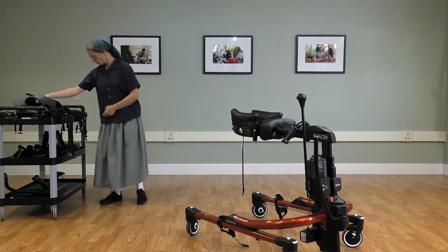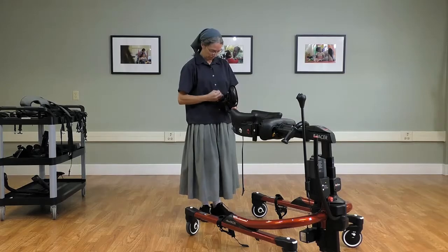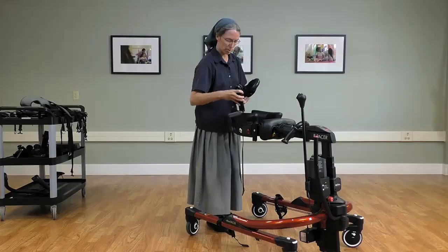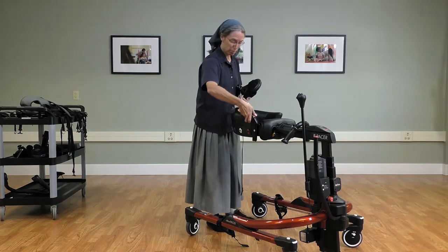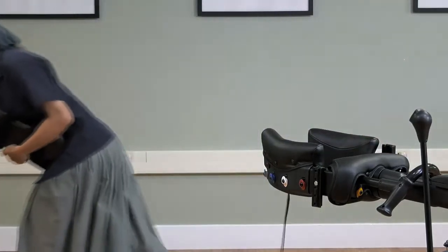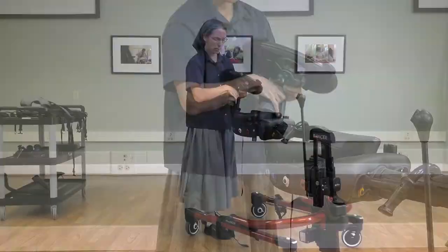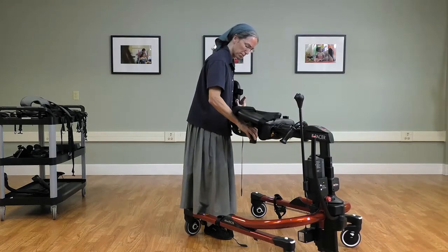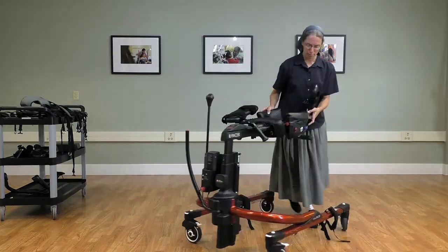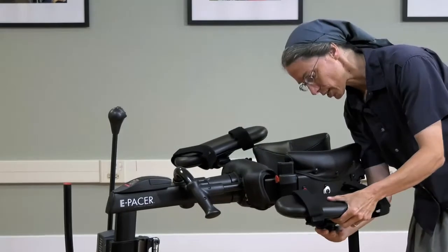We also have upper extremity supports, and these attach in the same way as we are familiar with from the tram — they secure onto the attachment here and can be put in a number of positions on either side. The arm platform is shown here, and I'll demonstrate the two possible positions: this is the forward position on the post with a slightly downward angle, and here we have the post back and down. If we spin this forward, you can see the comparison of positioning possibilities.